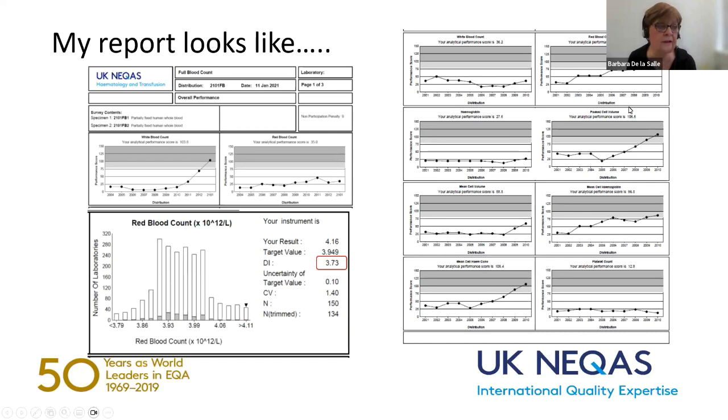We've got another item here, which is always worth looking at. We've got a plot here of several parameters which are all trending out, and this can happen, especially for calculated parameters where they are all interlinked. Sometimes one will go out before the other. However, it's important to look at these when you are trying to understand what might be causing it, and look at what is actually probably the measured parameter rather than the calculated ones to start with.